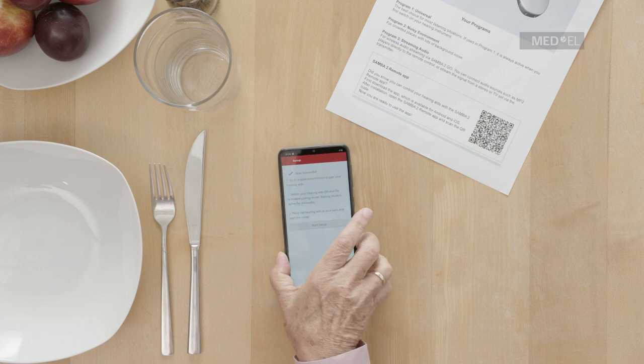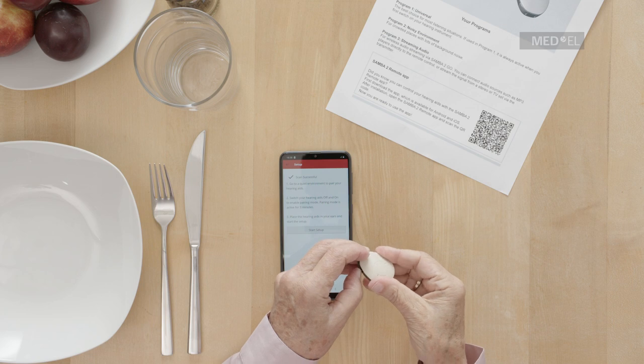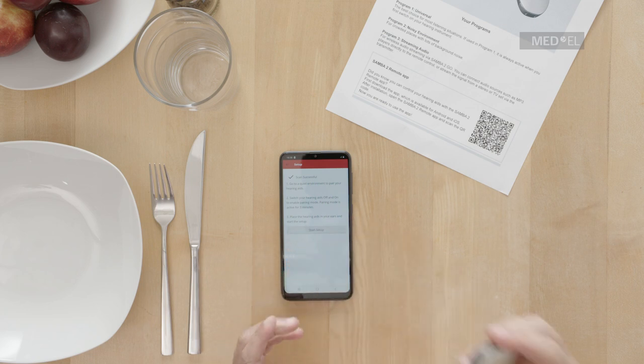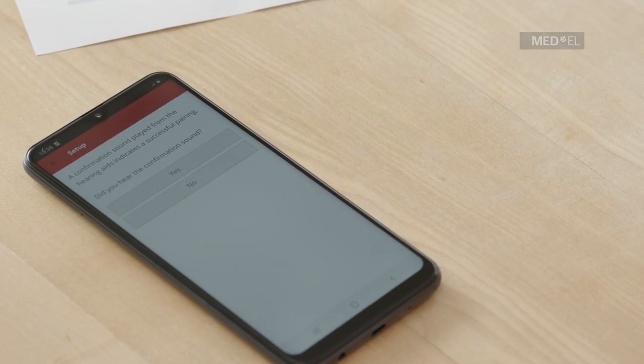Scan the QR code with your phone. Once you have successfully scanned the QR code, you are asked to switch your audio processor off and on to enable pairing mode. Place the audio processor back on your head and select Start Setup.